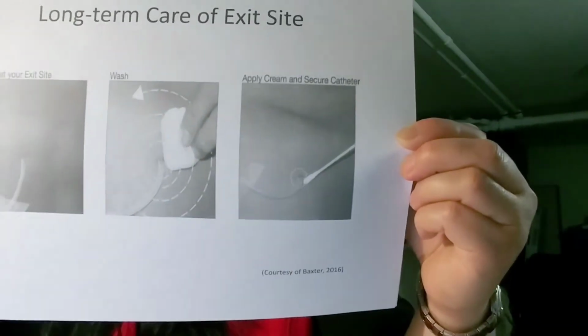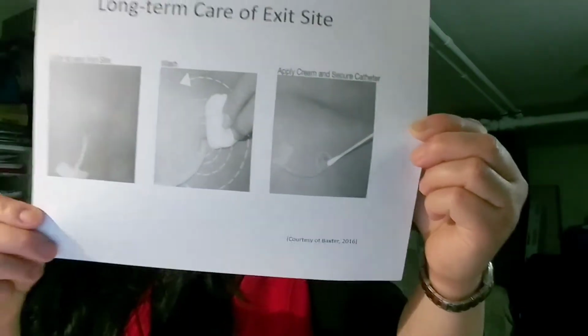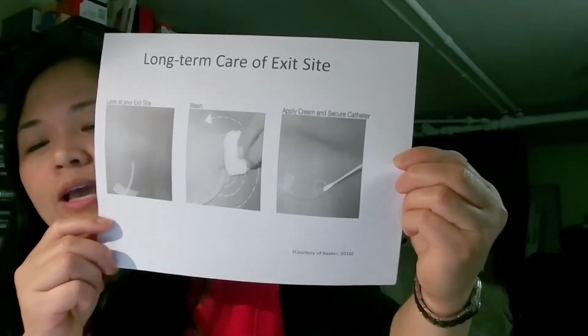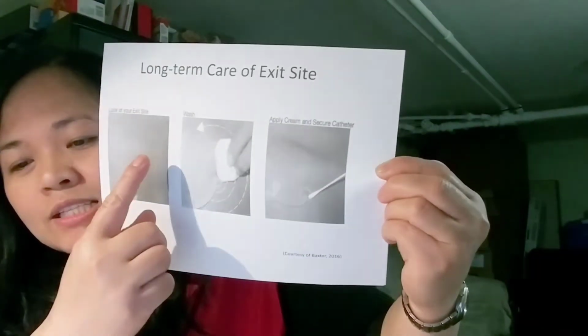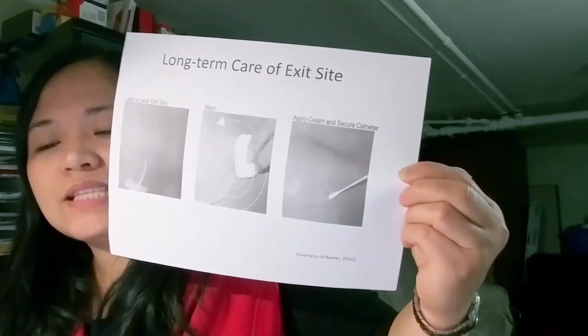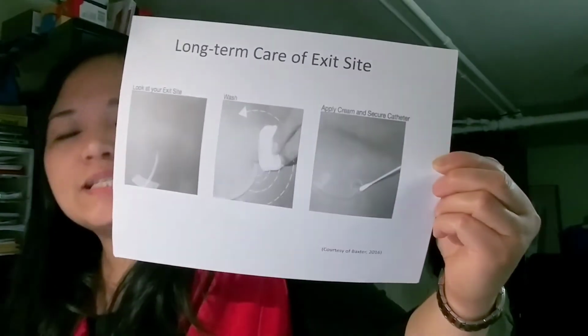The exit site should be covered and kept dry at all times to avoid maceration. Always secure the PD catheter to promote immobilization and to reduce the risk of trauma and infection. Swimming and bathing can still be considered as long as a waterproof or occlusive dressing is applied.